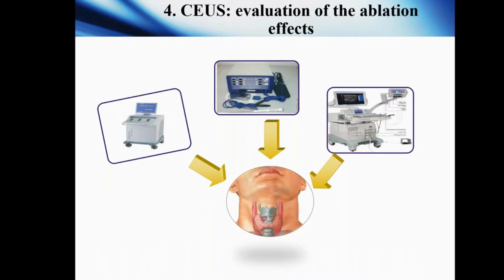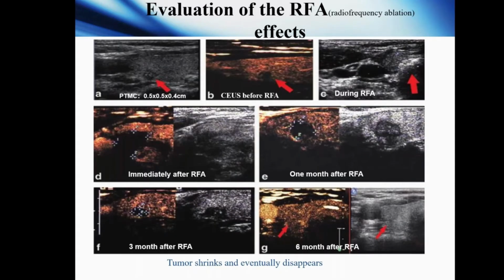CEUS can show whether the tumor is active or necrotic. So the outcome of tumor after ablation can be evaluated by CEUS. Now, let me show you a case who underwent radiofrequency ablation in our department.